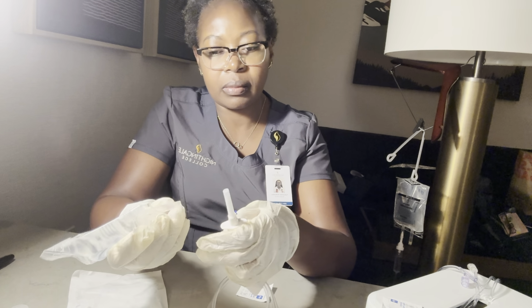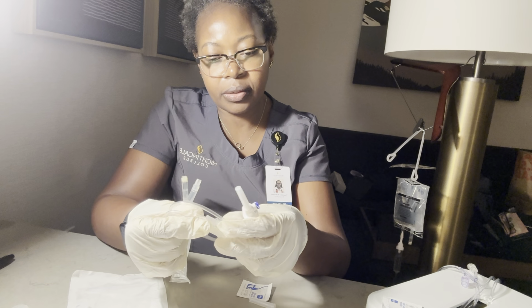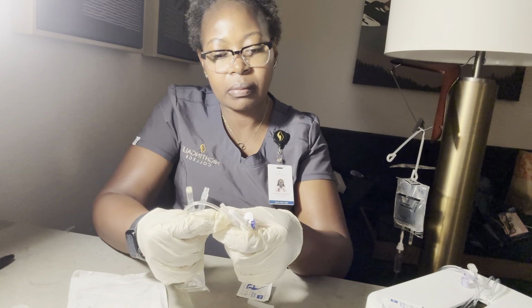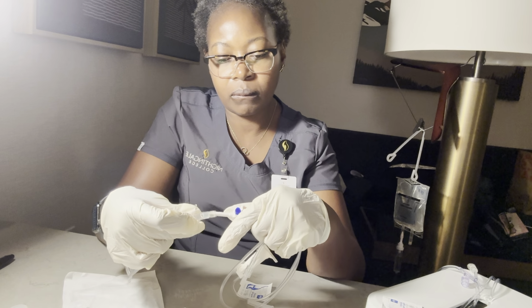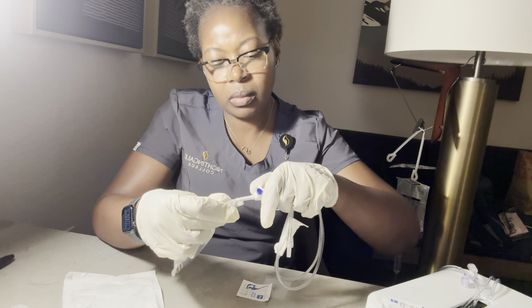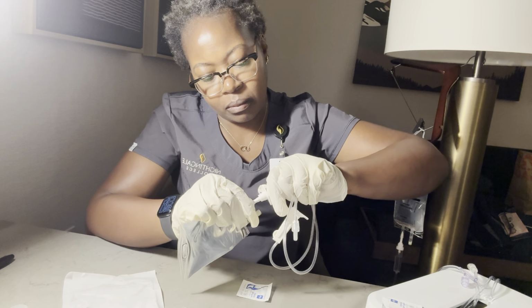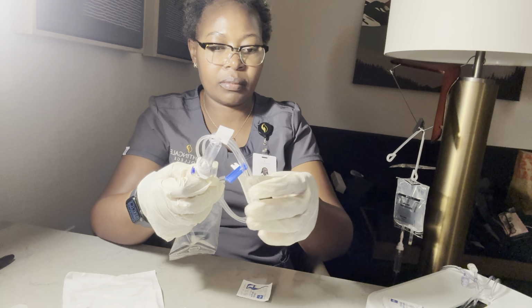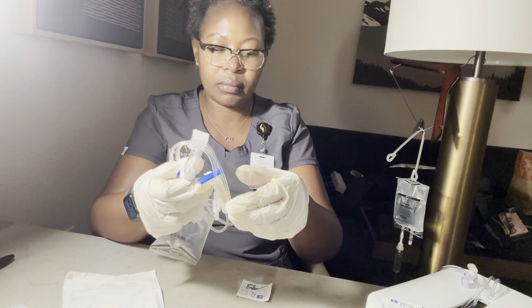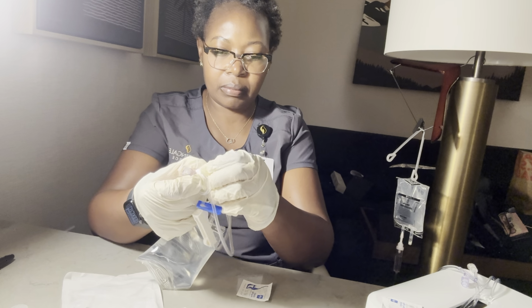Go ahead and make sure that the clamp is closed.